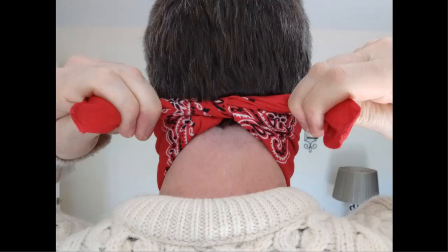Use those corners to tie your bandana, and you've just made a mask using a bandana.